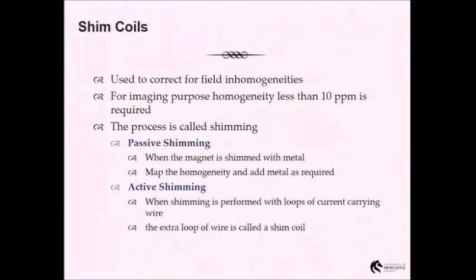And you can even shim down to very small volumes, which is what we do in spectroscopy, in terms of 1 cm cube.